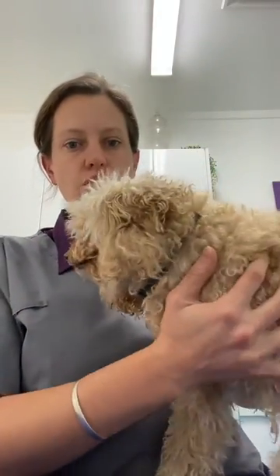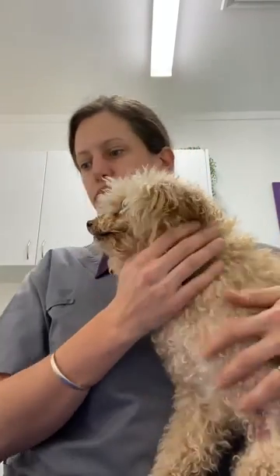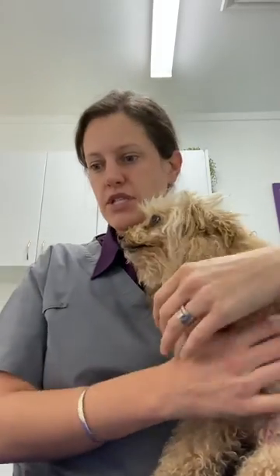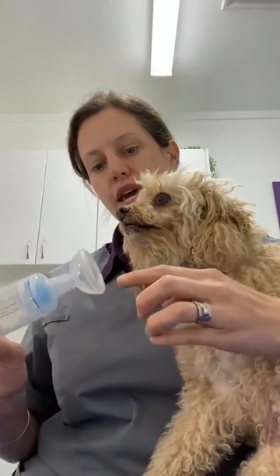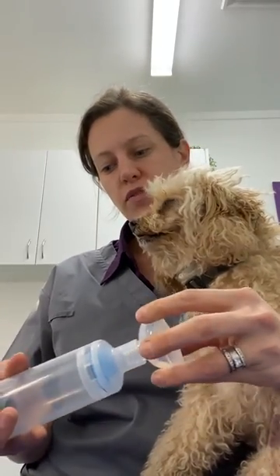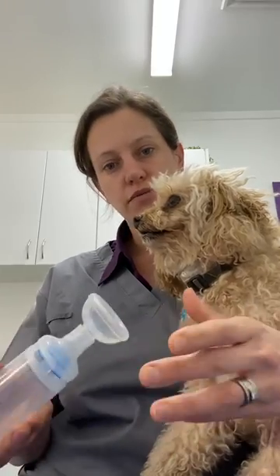Next I'm going to show you how to give the inhaler. Miss Holly here is going to demonstrate for you — she's new to this. What you're trying to do is create a reasonable seal with the mask around their nose. This one doesn't fit Holly perfectly; I'm ordering a specific one for her, but this is just for the demo.